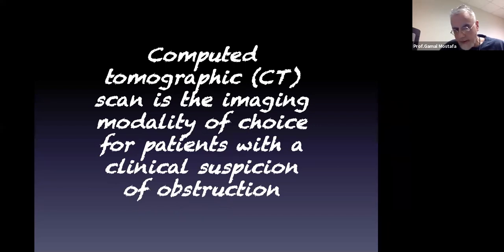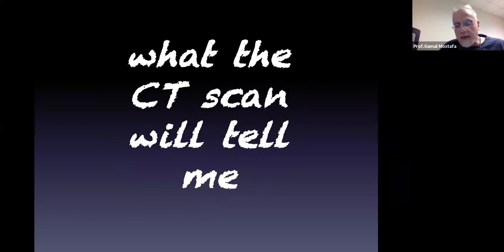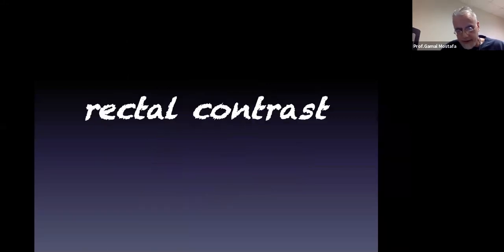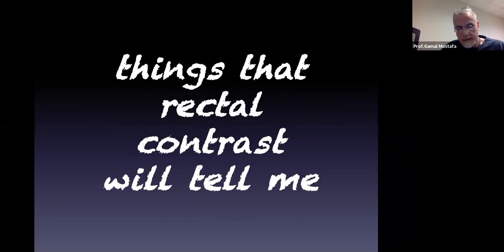Here we go. What the CT scan will tell you, I think we talked about that. Don't give oral contrast, you simply don't need it, and it will only delay you. So you really don't need oral contrast. Rectal contrast.